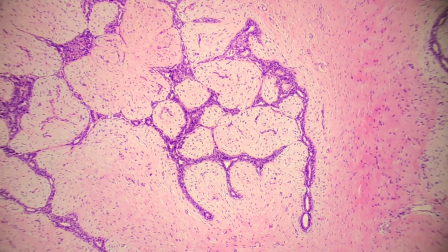So while I said you don't have to mention our patterns, okay, things that you do have to mention are stromal mitotic figures, as well as stromal overgrowth. And the reason you have to mention these things is because the highest thing on your differential is going to be phyllodes tumor, okay? So things that make you think phyllodes, and this view might make you think, is this phyllodes?